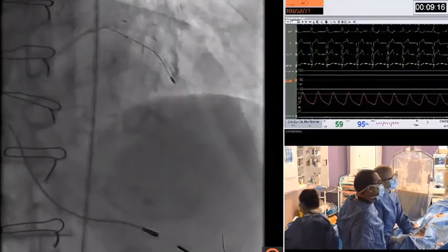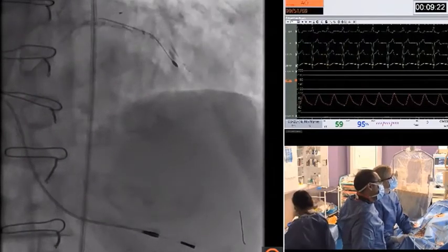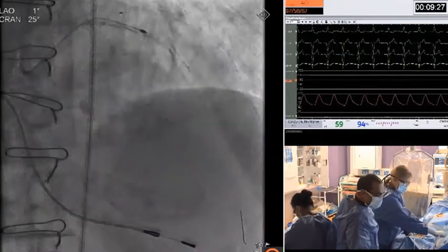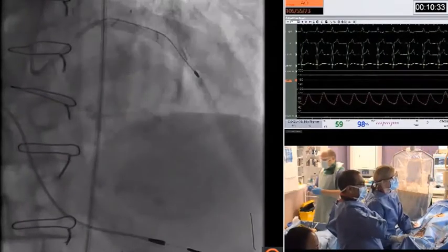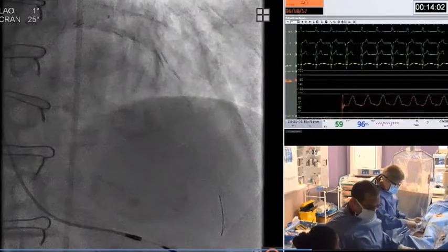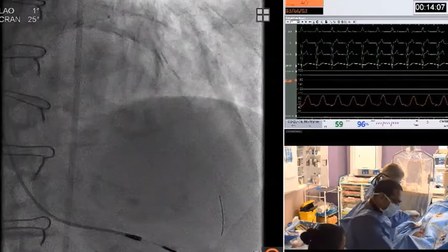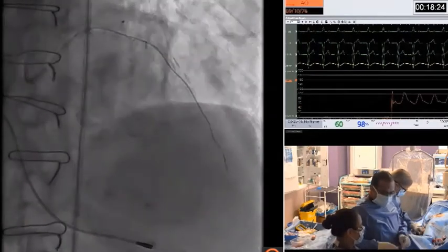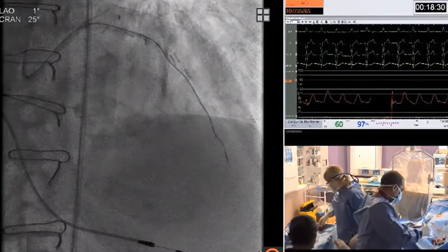It's a quite resistant lesion, requiring several passes. See, we just crossed the occluded segment. The burr is then removed, and we used the Caravel 135 catheter again to exchange for a workhorse wire, in this case a Sion Blue.